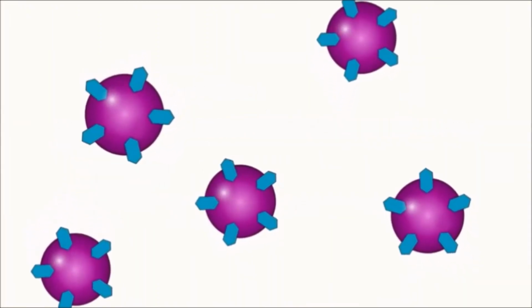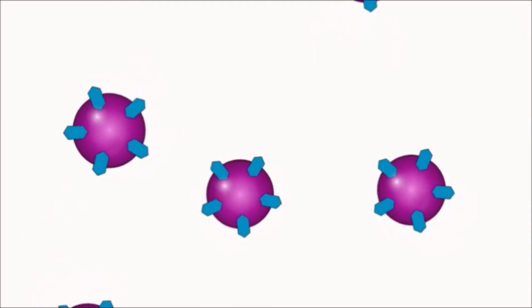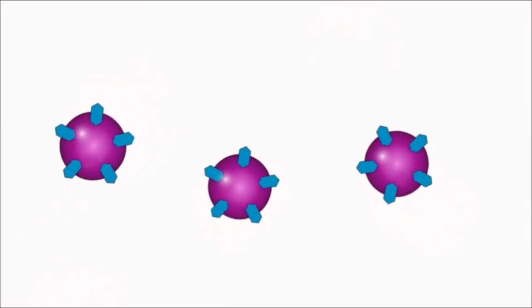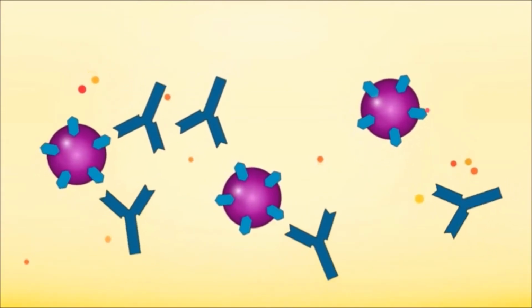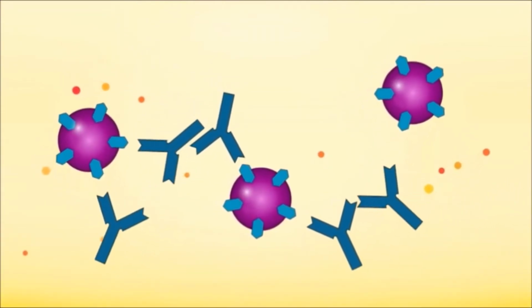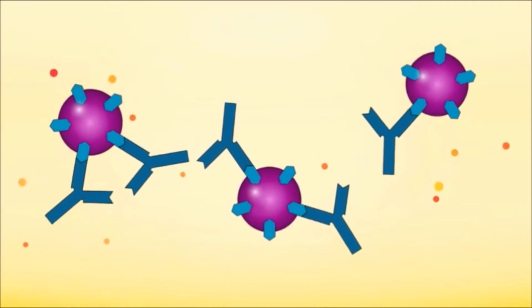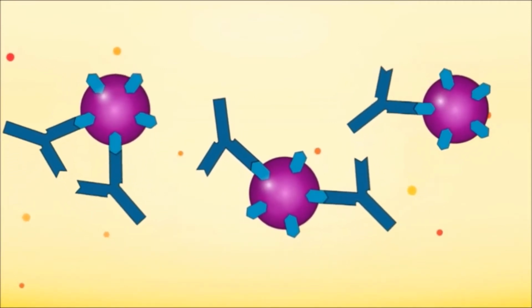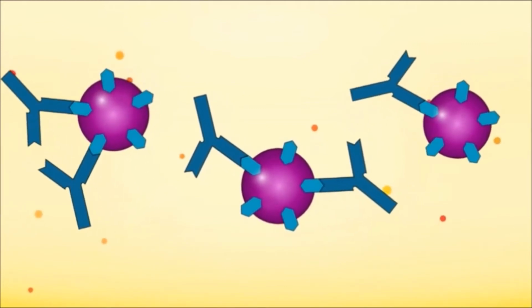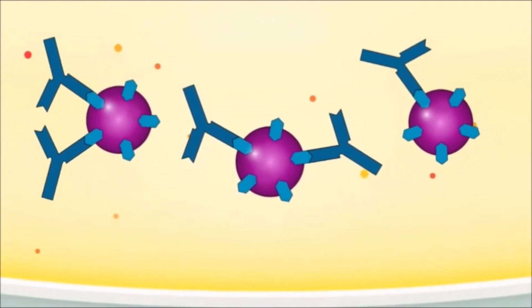In APS testing, the HemosIL reagent has magnetic beads coated with the antigen. When combined with the sample to be tested, antibodies present in the sample bind to the beads, creating the initial antigen-antibody complexes. The unwanted residuals are removed by a process known as the magwash.